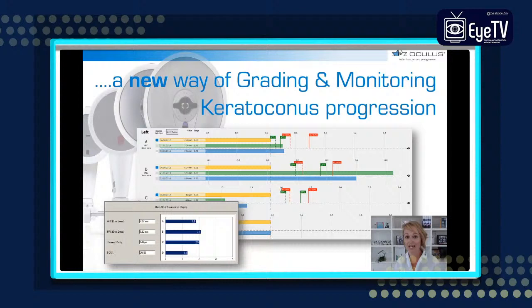The ABCD staging uses 4 parameters to grade keratoconus. This staging is incorporated in the ABCD progression display, a display which monitors and detects early keratoconus progression, in many cases, way before changes in Kmax is detected.